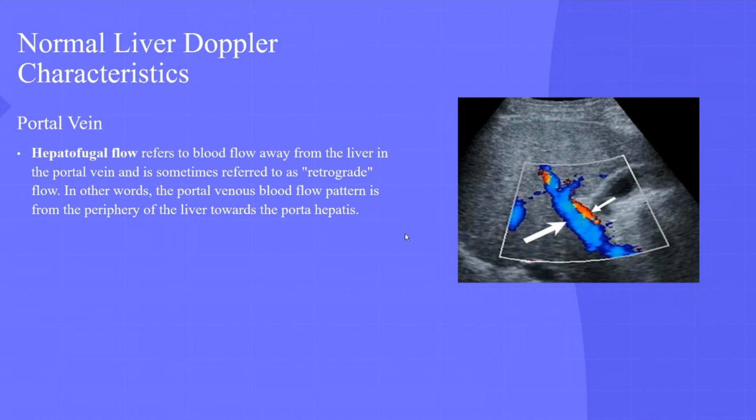Thus, the portal systemic shunts are reopened, with additional findings that include a narrower portal vein and prominence of the hepatic artery. Occasionally, a to-and-fro bidirectional blood flow pattern alternating between hepatopetal and hepatofugal flow can be seen in the portal vein before the onset of flat hepatofugal flow.